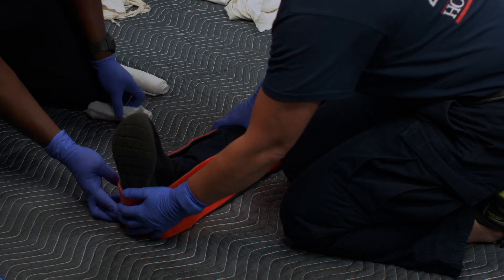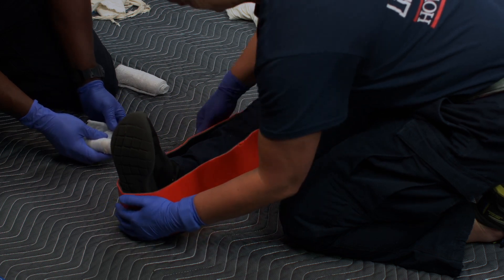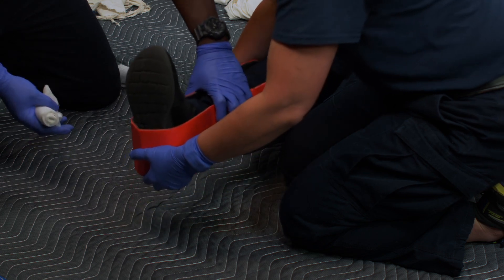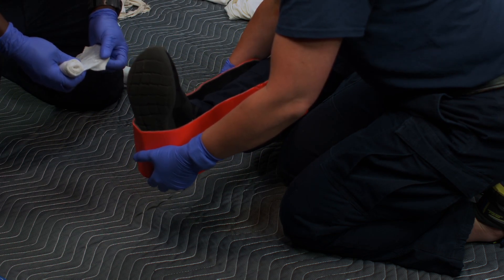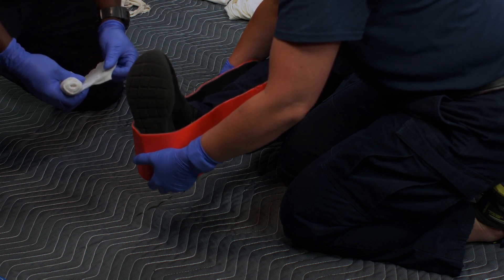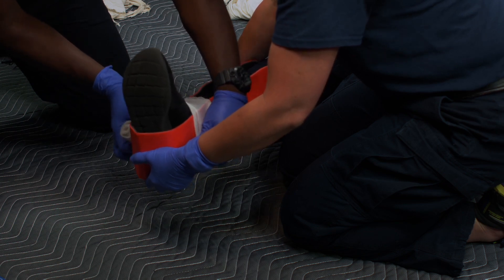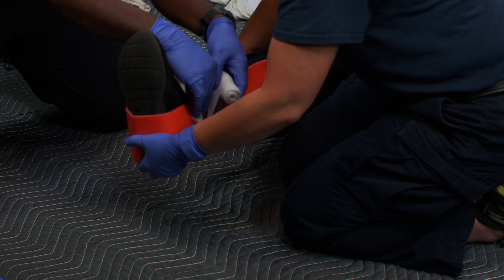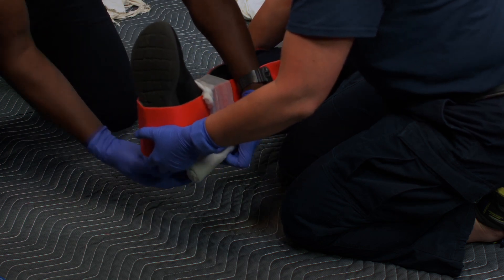The first provider will then need to raise the patient's leg, assuring that they support under the foot and under the ankle. The second provider will wrap cling from the top of the foot up to the end of the SAM splint.